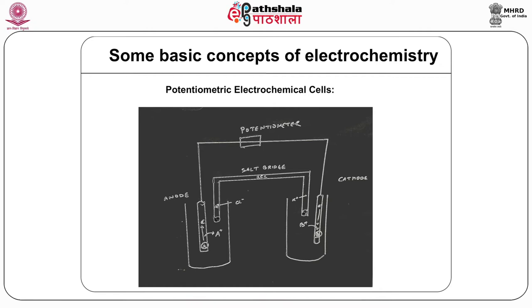Now, frit is a ceramic composition that has been fused in a special fusing oven, quenched to form glass and granulated. The porous structure permits the movement of ions of the electrolytes freely between the two half cells and the salt bridge. This movement of ions in the bridge completes the electrical circuit. Now, by convention, the electrode on the right is the cathode and the electrode on the left is the anode. That we can see in figure number 1.